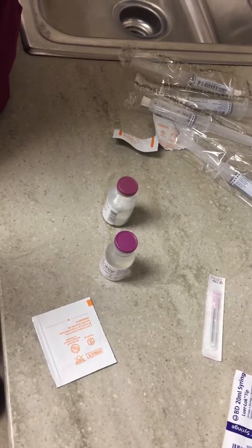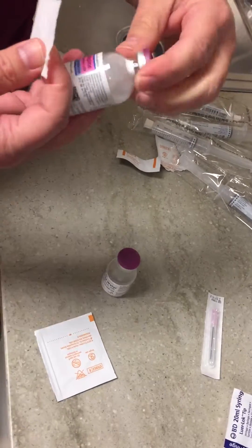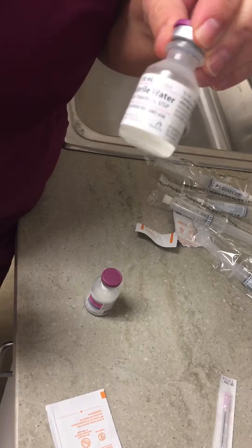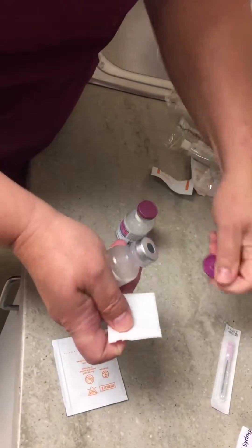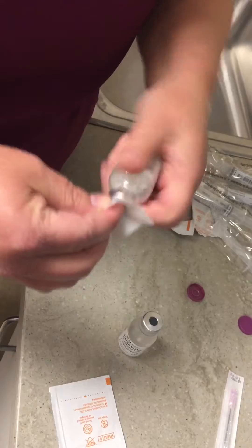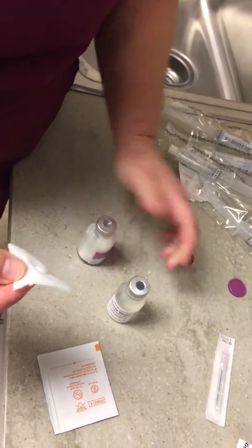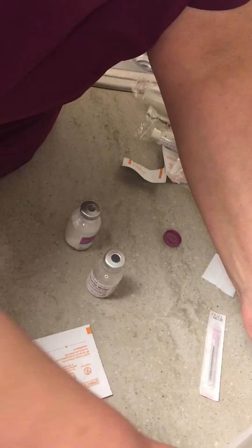I am going to mix cefepime in 20ml of sterile water. This has been very difficult, but we're doing this because of a shortage of 50ml bags of IV fluid to mix it in. Hopefully this will help people figure out how to do that a little better, a little neater, and a little safer.